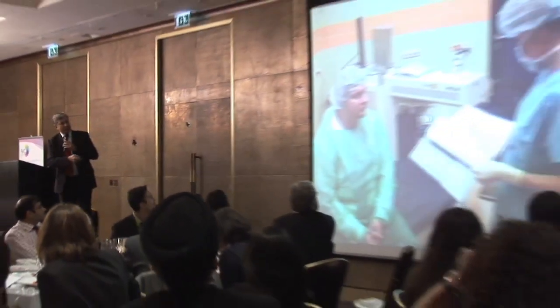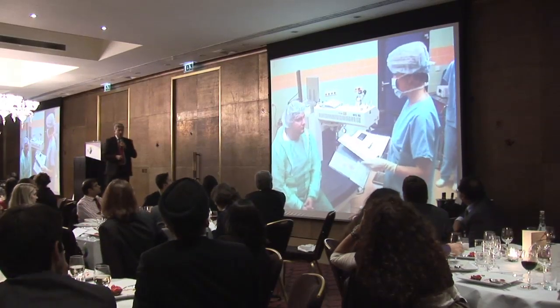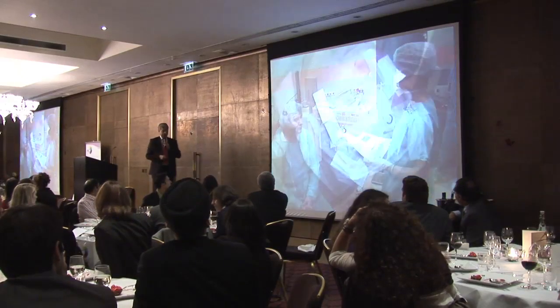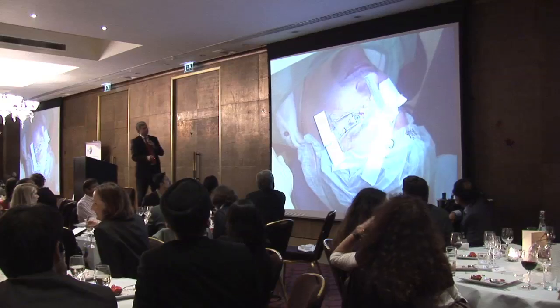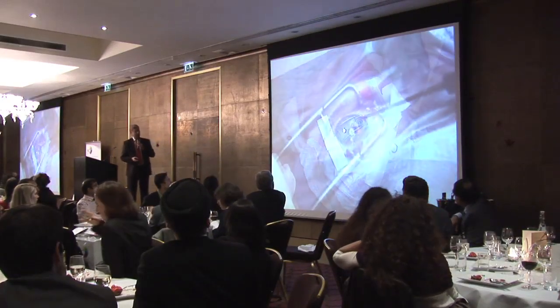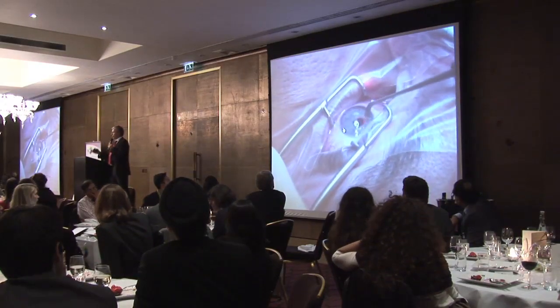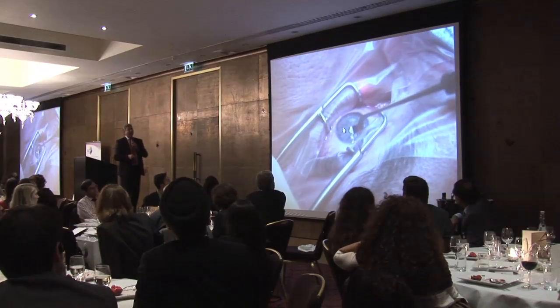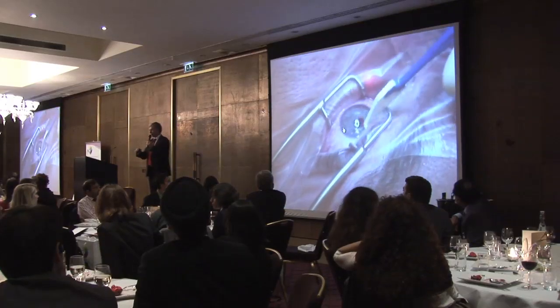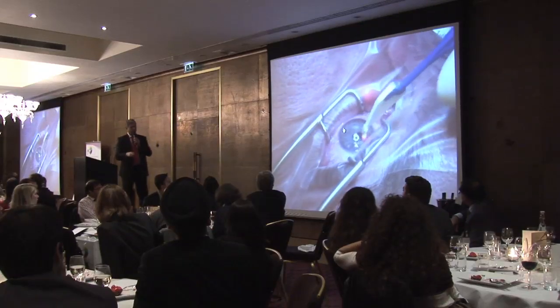We do it in the laser operating theater. It's actually a very long procedure. It's easy but long, about 1 hour. First, you have to anesthetize the cornea. This is topical anesthesia. Then there is a long discussion about whether you should debride the epithelium or not. Some do, some don't. You can do it also by laser. You can remove about 40 microns of epithelium, and then you can put the drops of riboflavin.